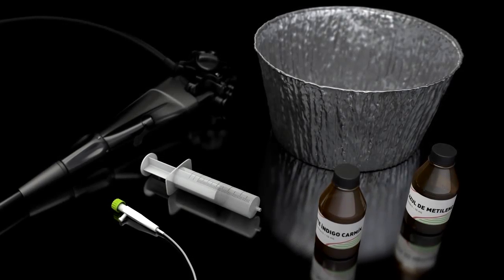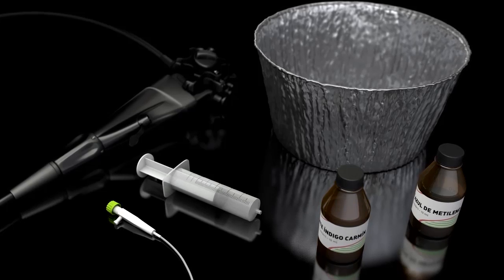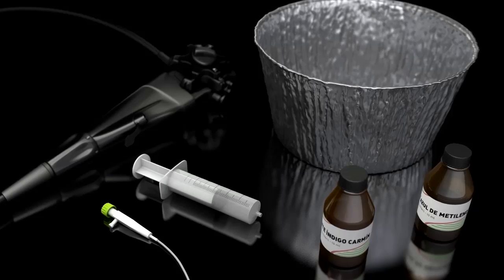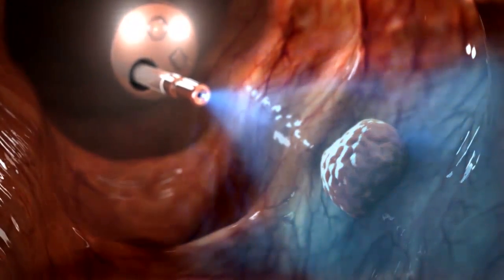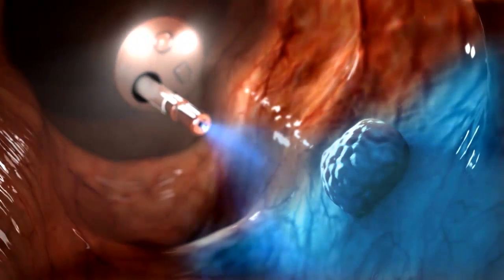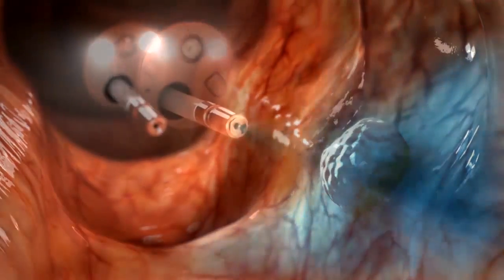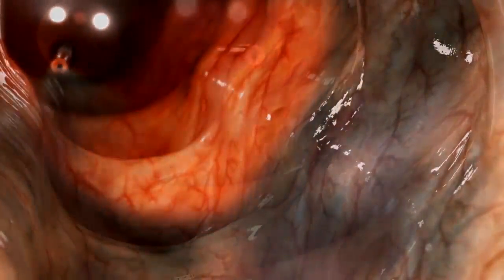Chromoendoscopy is based on the topical application of dyes during endoscopy with the objective of improving visualization, identification and characterization of the premalignant and malignant lesions. For specific lesions, directed staining is used, while for monitoring dysplasia in inflammatory bowel disease, pan-chromoendoscopy is recommended, with non-directed staining of the entire mucosa of the colon.